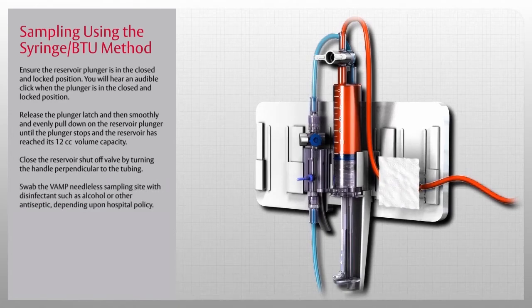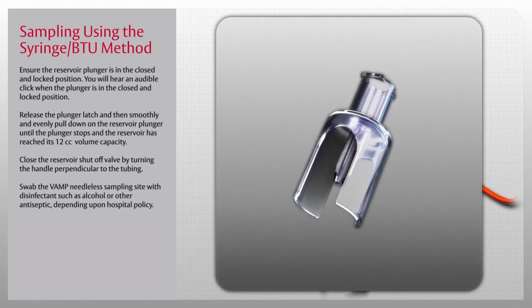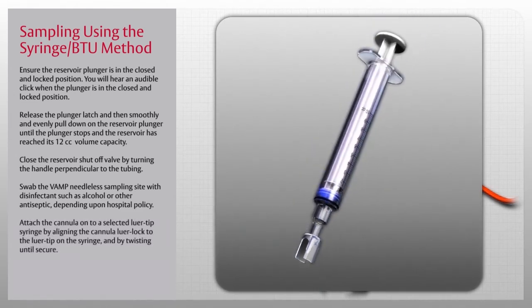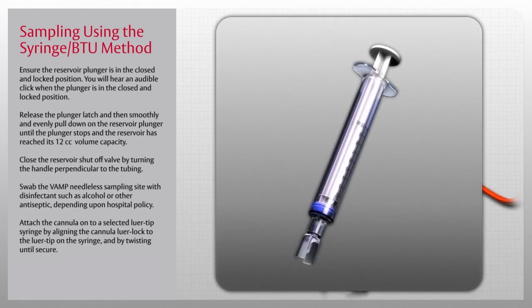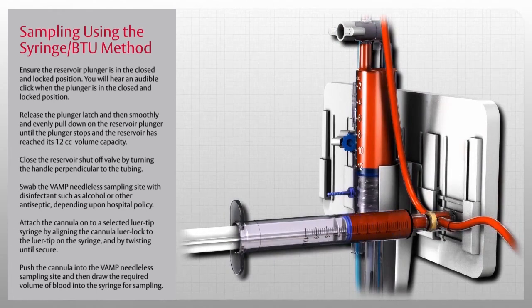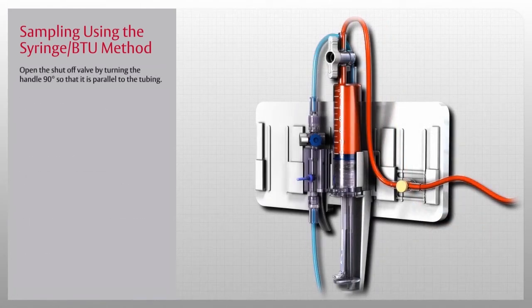Swab the VAMP needleless sampling site with disinfectant such as alcohol or other antiseptic depending on hospital policy. Next, obtain an individually packaged VAMP needleless cannula and luer-tip syringe. Using aseptic technique, peel open the cannula pouch, pick up the cannula by the protective shield, and attach it onto the selected luer-tip syringe by aligning the cannula luer lock and twisting until secure. Ensure the syringe plunger is depressed to the bottom of the barrel. Push the cannula into the VAMP needleless sampling site and draw the required volume of blood into the syringe. Do not use a hypodermic needle through the sampling site. To remove, grasp the cannula and pull it straight out.